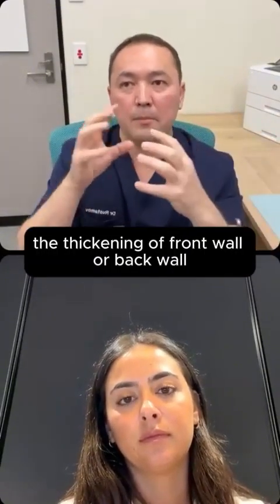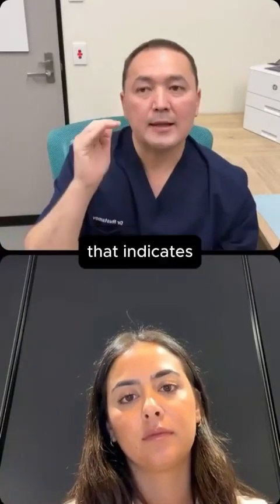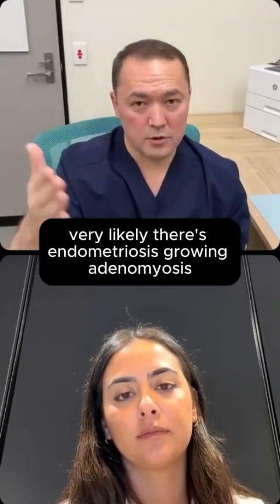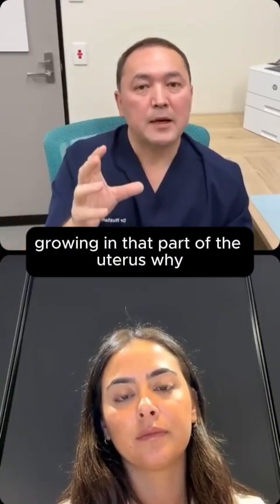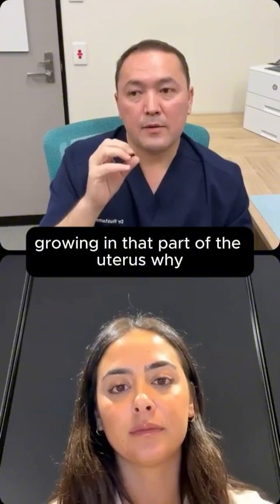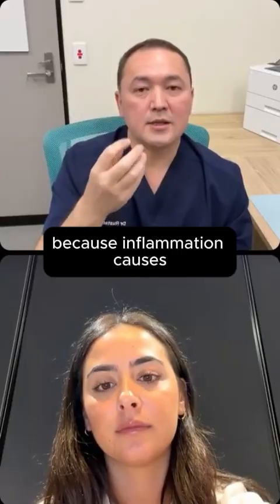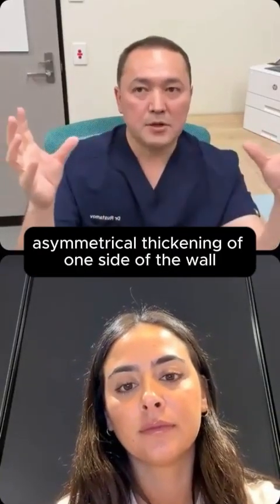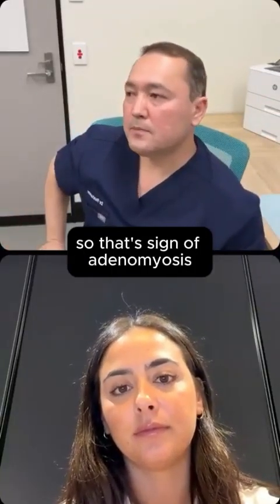If you have a thickening of the front wall or back wall, or one of the lateral walls, the side walls of the uterus, that indicates very likely there is endometriosis growing, adenomyosis, which is a type of endometriosis, growing in that part of the uterus. Why is it thick? Why is it asymmetrical? Because inflammation causes swelling of that local part of the uterus, and then you have an asymmetrical thickening of one side of the wall. So that's a sign of adenomyosis.